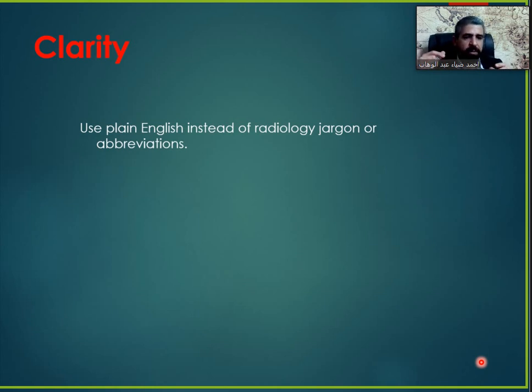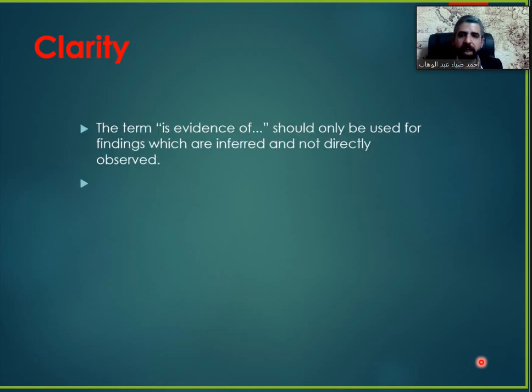Use the word suggest, suggest this, instead of suggesting the presence of this. Use just suggesting cancer instead of suggesting the presence of cancer. Use the word metastasis instead of mets. Metastasis is more obvious. Okay.